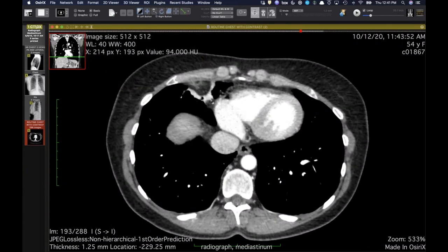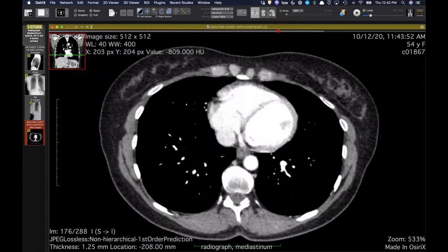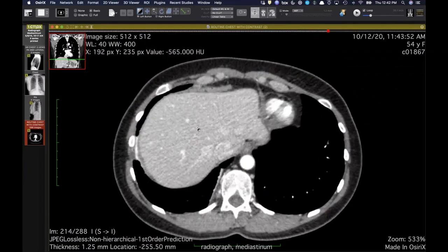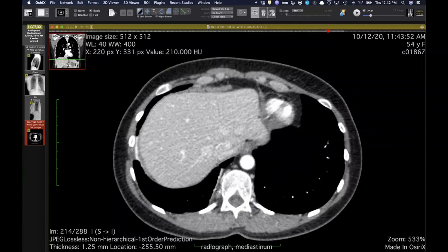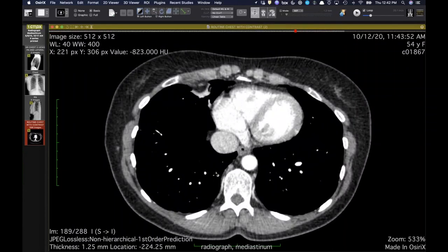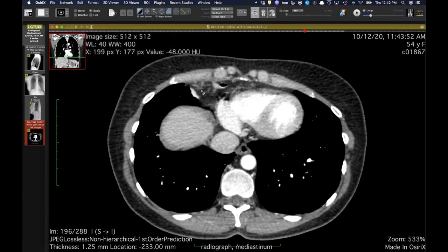You've got a little bit of atelectasis in the lung next to it. I think in more than half of the cases we show, you also see an ipsilateral pleural effusion. I'd like to see that here, but we don't really. I think you're just seeing mostly splinting or difficulty taking a big breath. But do you guys agree? It just looks like an atypical appearance and location of mediastinal fat necrosis.